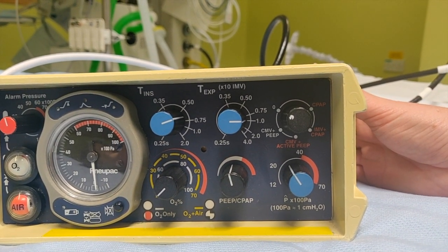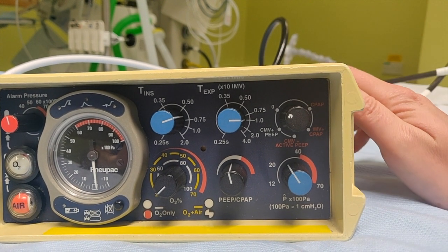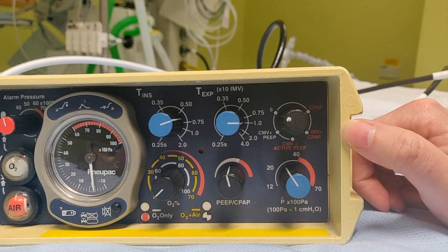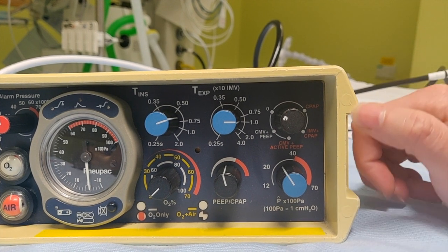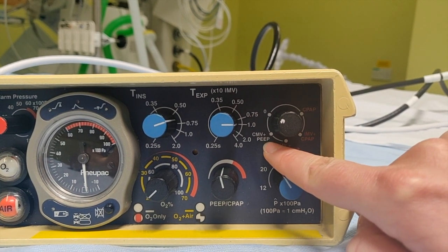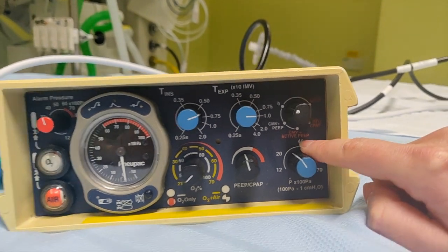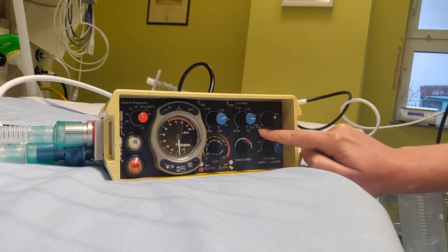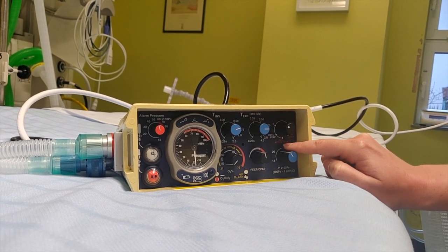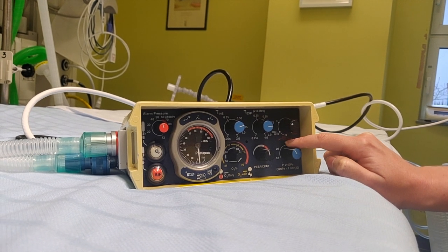On the right top corner, you see that you have a pure CPAP mode, which you'll hardly use, but it might become handy if you're struggling with CPAP machines for bigger patients. Then you have an IMV mode that will activate with the patient, but it's not very effective. And then we have CMV plus PEEP — that is continuous mandatory ventilation with PEEP — and CMV plus active PEEP. The difference between the two is that the first one keeps the PEEP by holding the gas during expiration by closing the valve, while this one keeps it by maintaining a high bias flow, air going around the circuit. This one consumes much more gas.